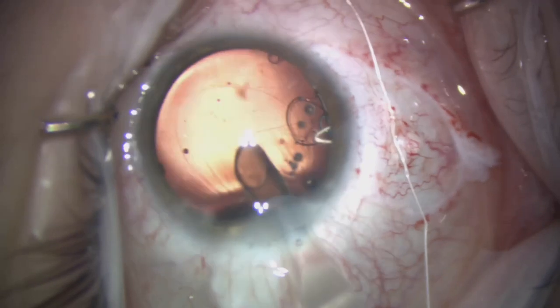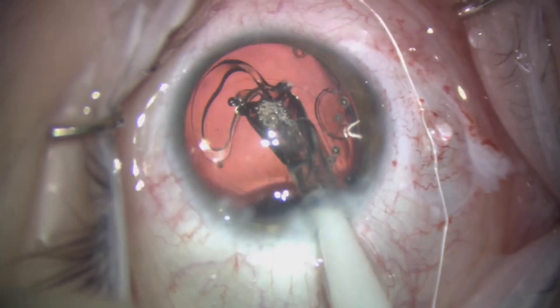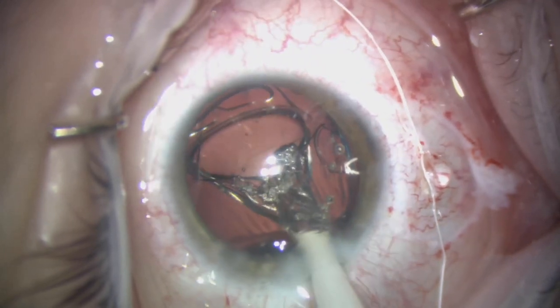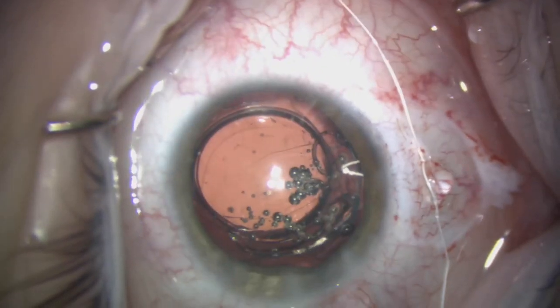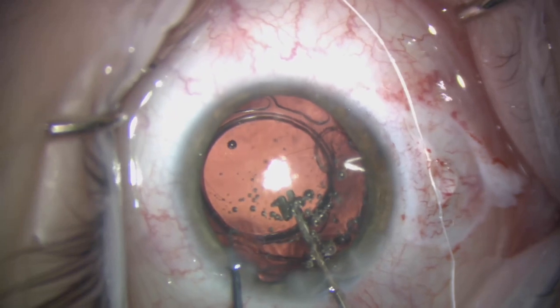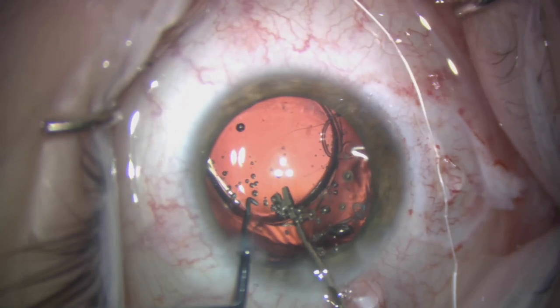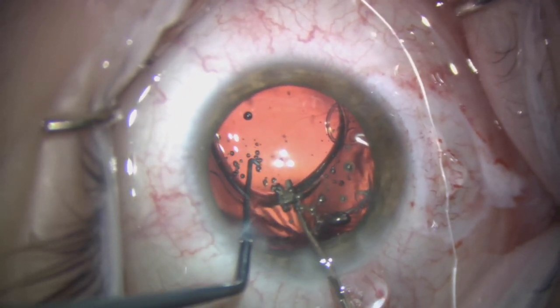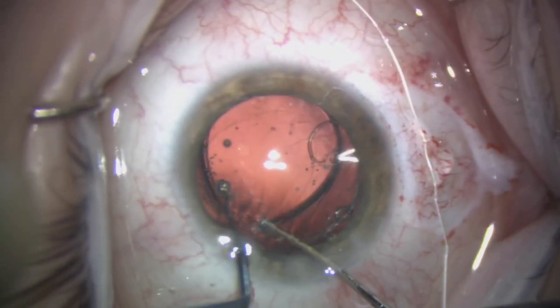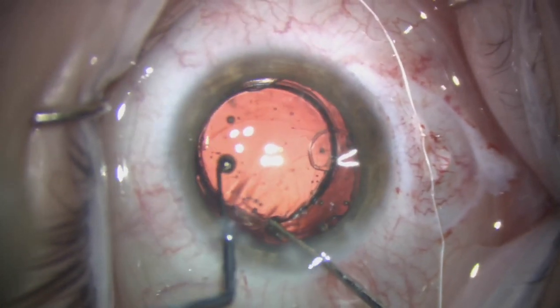You can now see the capsular bag is nicely centered. We're going to place a single-piece Rayner hydrophobic lens into the capsular bag. The capsular bag is a little on the small side, so the haptics are not quite fully opened up, but this is not usually an issue. As the capsulorrhexis is a little small, we use a Kuglen hook for counter-pressure on the edge of the capsular bag and get the lens into the bag without a problem.